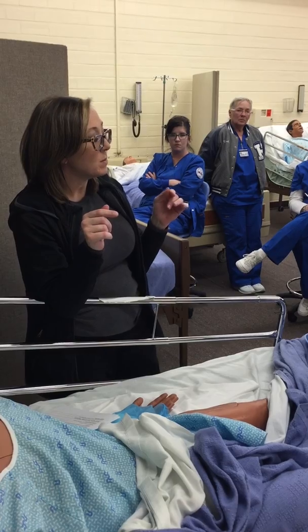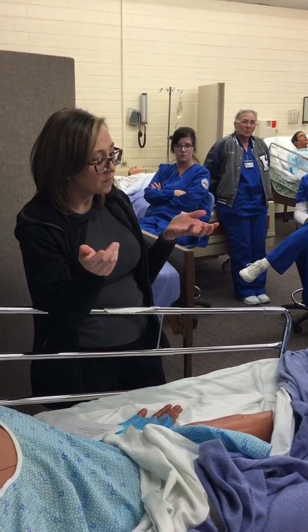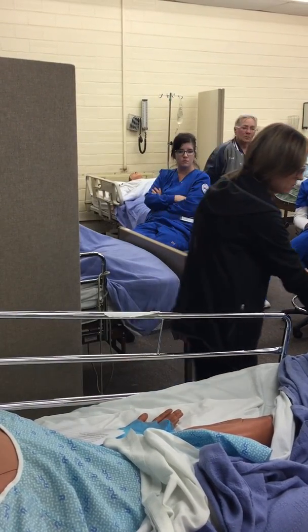So when we're cleansing, we put on sterile gloves, yes, no? Okay, so I'm going to put on my sterile gloves.